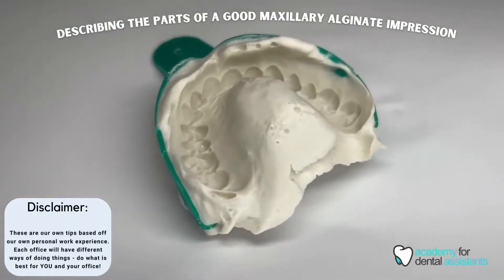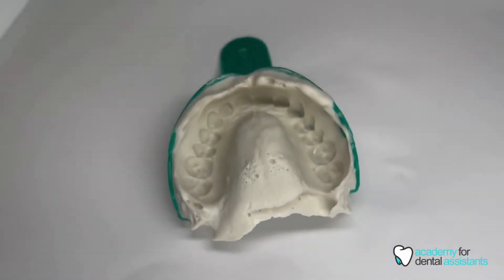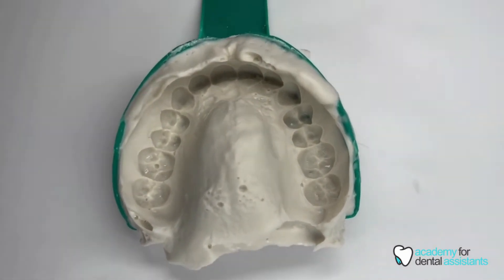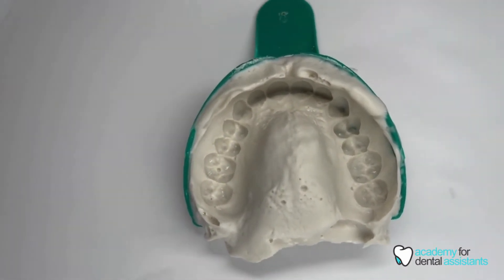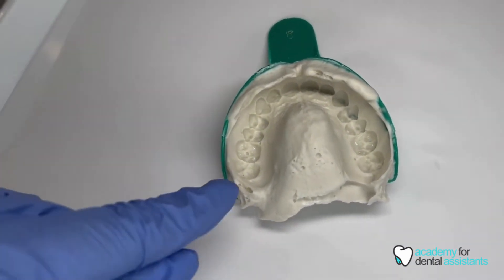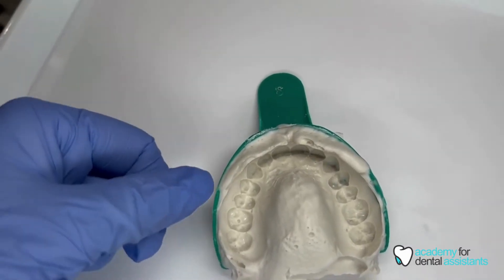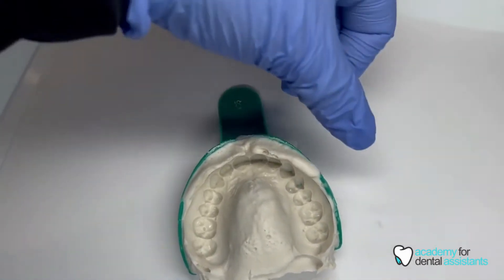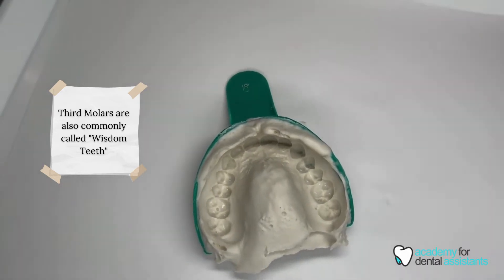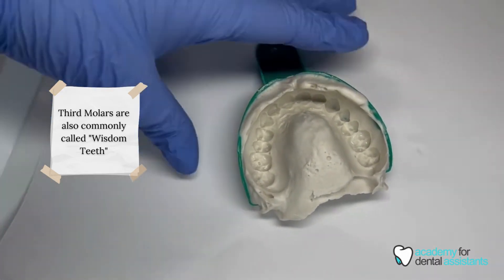This is an example of what a good impression will look like. As you can tell, if you look at these teeth, this patient has already had their third molars extracted. You can see in the upper right as well as the upper left quadrant that there are two molars on both sides. This patient has had them extracted — they're also known as wisdom teeth.